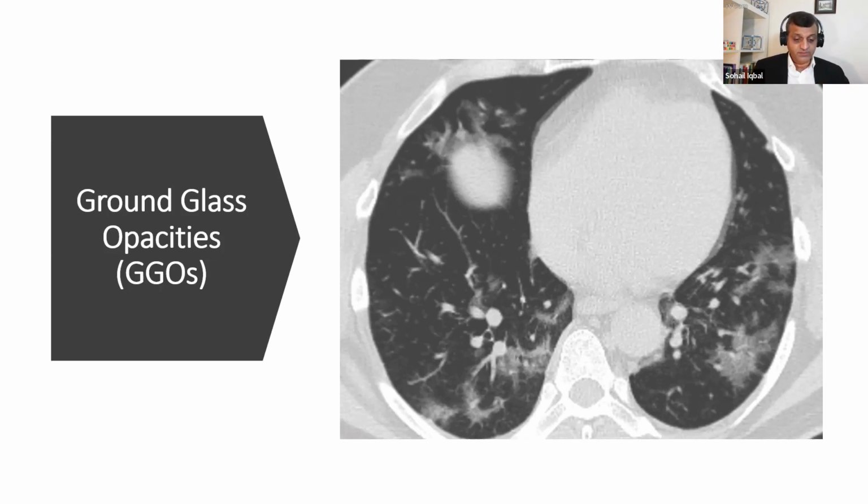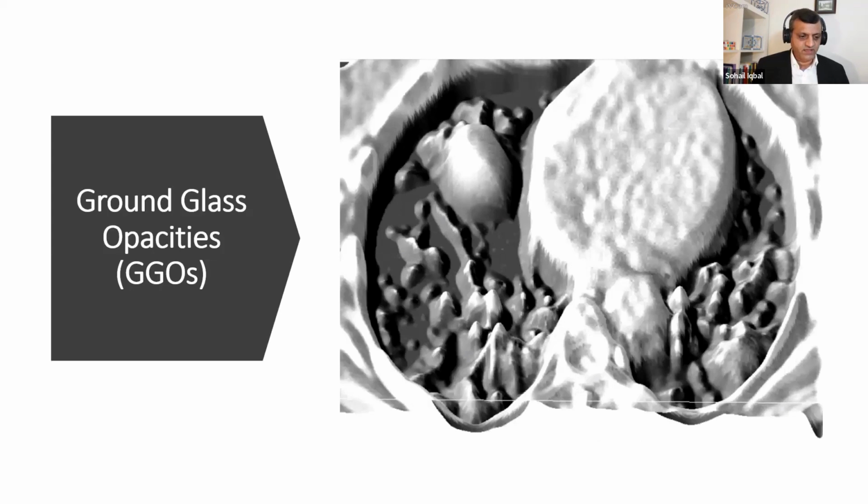Unfortunately, these persistent diagrams, which we just constructed, cannot detect these things. And these are the initial stages of COVID. These are more common in a CT scan, so that's why they are more important. In the second last slide, I'll try to show that the next strategy gives us a much higher percentile of results, because in most of the images there are more ground glass opacities compared to consolidations. So that's the next thing.